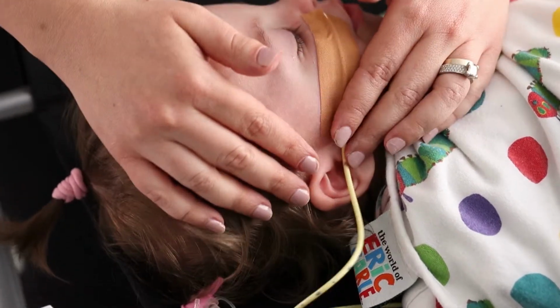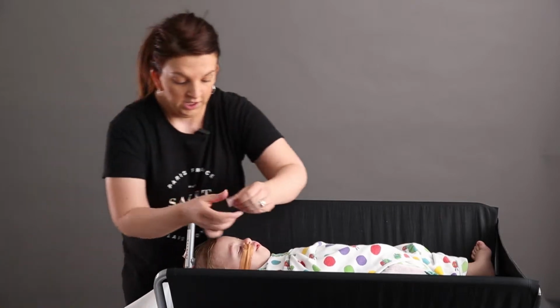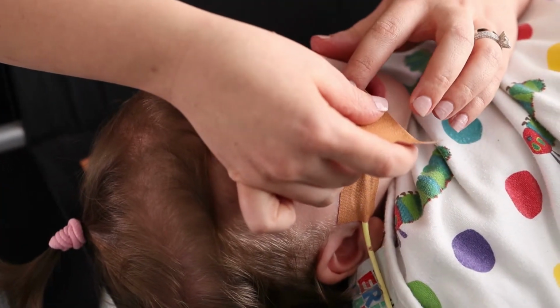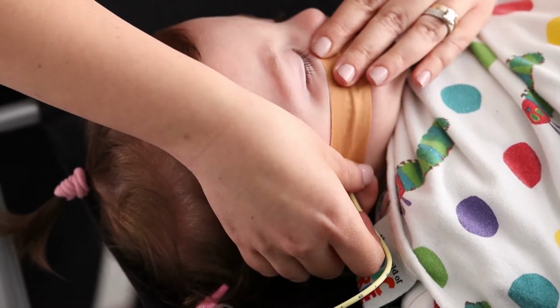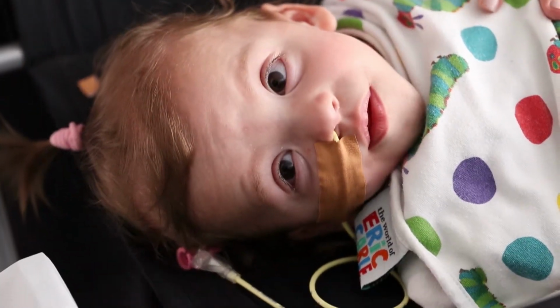If you like, you can put another piece of tape on. I like to do that because I know Emily's a bit of a wiggly worm and she likes to pull her tube sometimes. So the next one I just put on top, and that's it. It's quite secure. She's fine. She's not in any kind of pain and we're done.